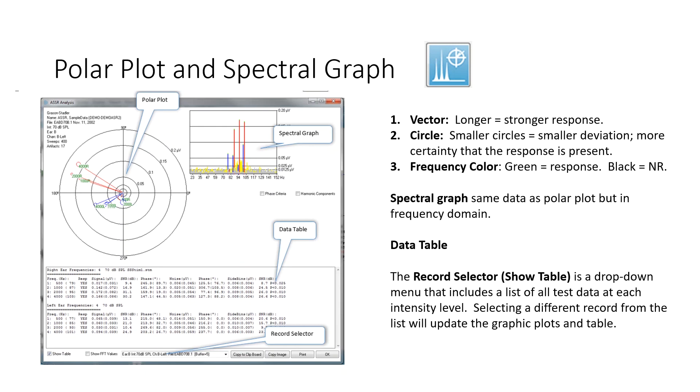And then finally, down at the bottom is the record selector. So in this case, I'm looking at responses at 70 dB SPL, but I would have to select lower intensities, if I went lower, or different intensity levels, to see the specifics of each one of those levels, and the polar plots for each.